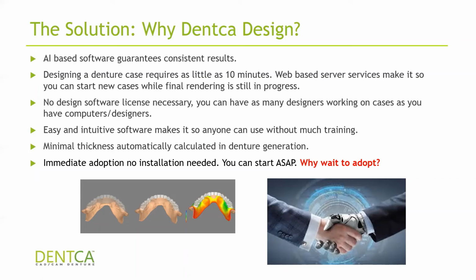And this is especially important with implant overdentures, where we create a space for the IOD, and then we bulk it up to ensure that it's properly reinforced. Whereas if you have a regular denture where you're drilling a hole, you're either going to end up with less thickness than what you want, and that thickness space is probably going to be filled up with auto-curable acrylic, and it's not the same quality as the regular acrylic.